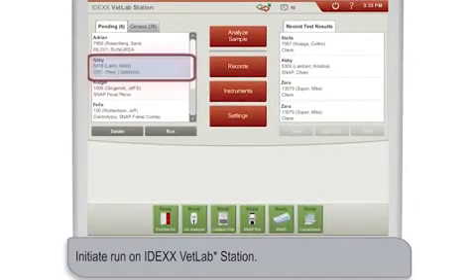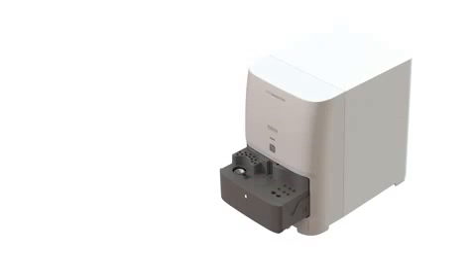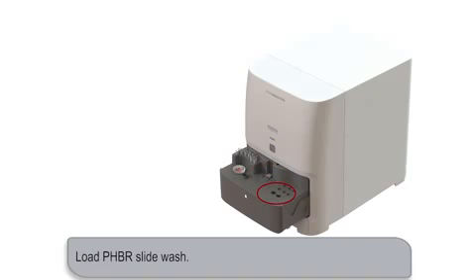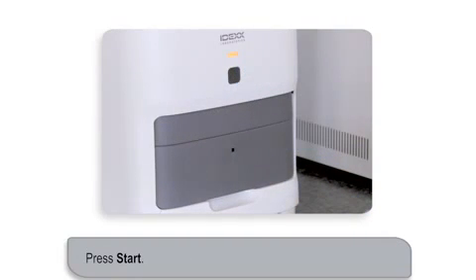After you've initiated the sample run on the IDEXX VetLab Station, it's time to load the materials into the Catalyst One Analyzer. First, ensure the pipette tip area of the drawer is full. Next, load the sample. Then, load the phenobarbital slide. Next, on the right side of the drawer, load the phenobarbital slide wash into the front cup holders. Close the sample drawer and then press the Start button.